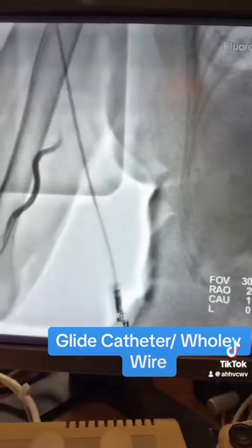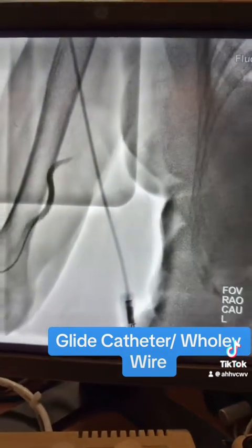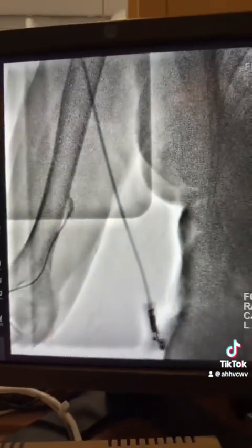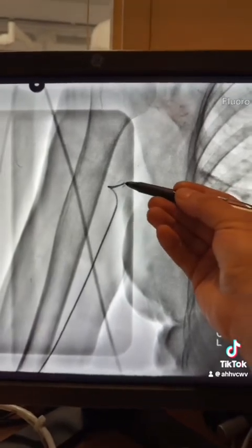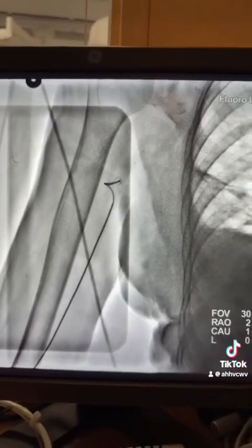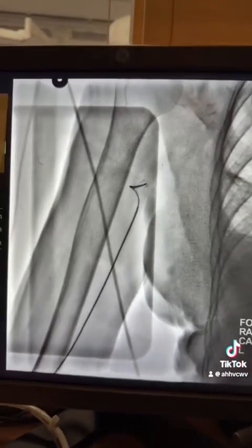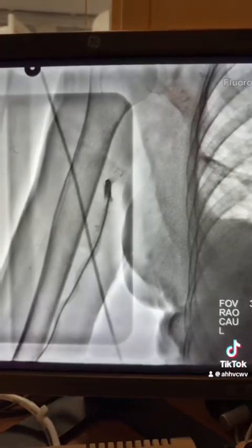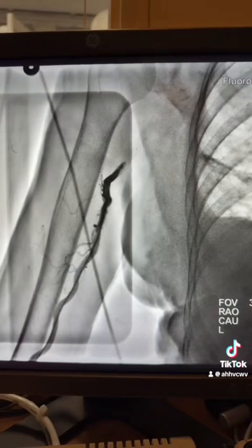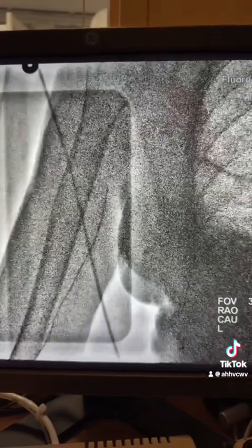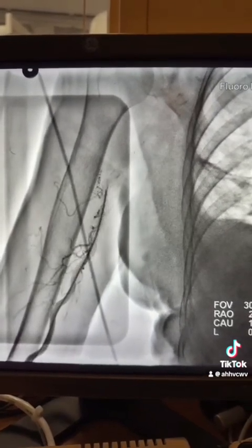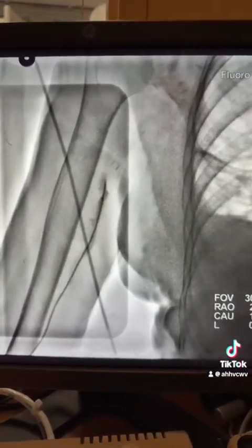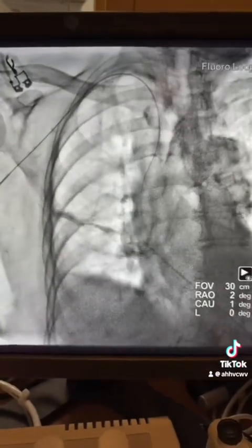Once the wire is advanced, also in the brachial-axillary area there is another lesion, as you see here. The workhorse wire got stuck here, so I have to take pictures with the Glidecath, then advance the workhorse wire again.